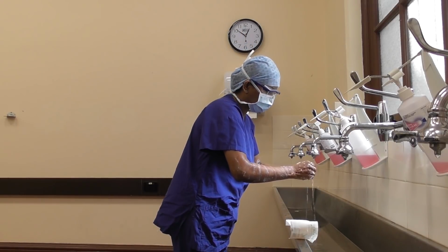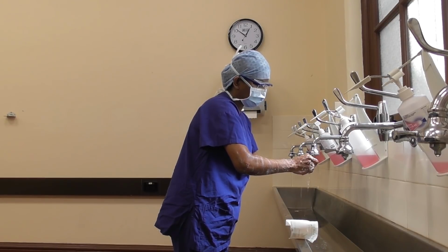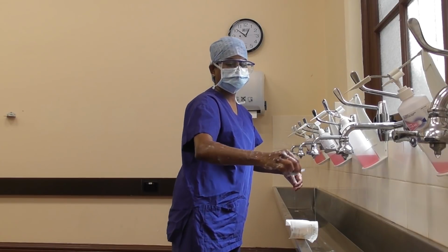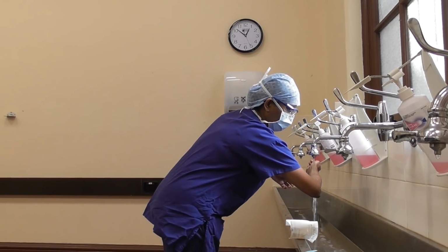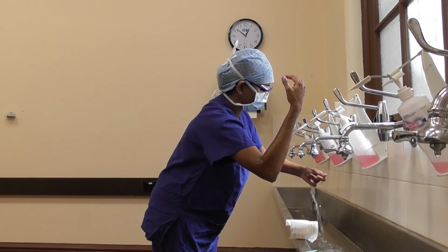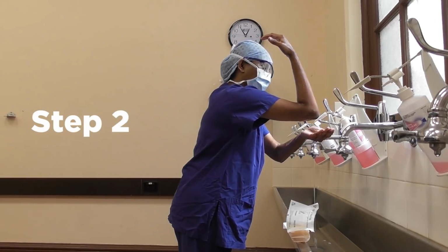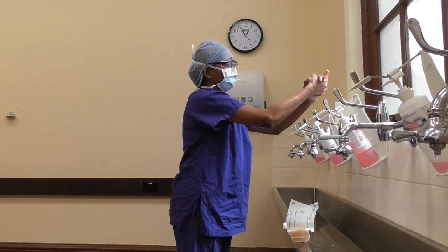Under running water, use the nail pick to clean under the nails. At the end of 1 minute, discard the nail pick and wash your hands. Wash hands by going in one direction only. Pump more disinfectant and fully apply the product to 2.5 centimeters above the elbow.